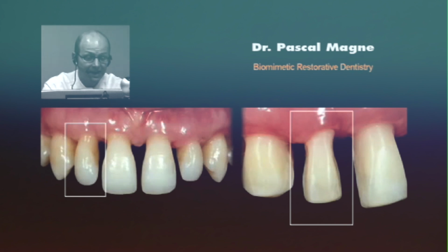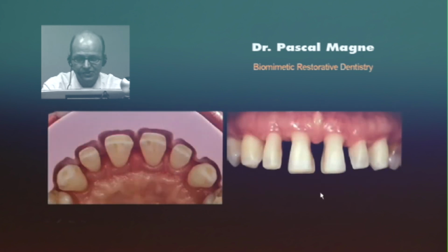But I could maintain enamel where it was already present, and this is so precious, and you can do that only with this horizontal insertion path. The incisal edge, as you can see, was prepped absolutely horizontally and flat. On the palatal side, you see the enamel is intact, absolutely intact. We didn't need to invade that area.